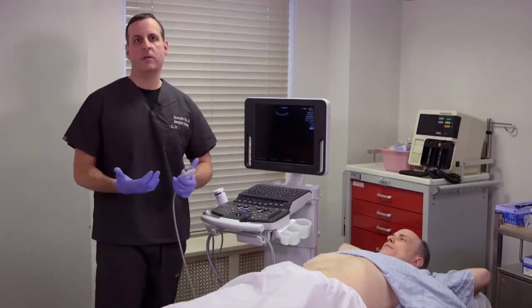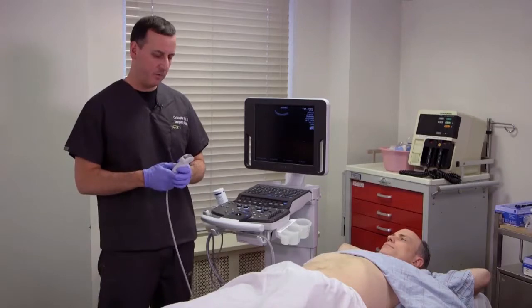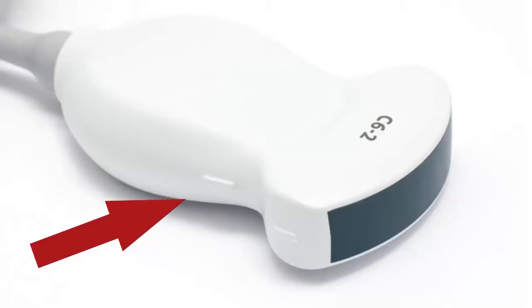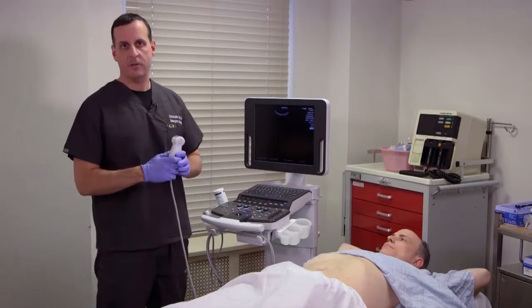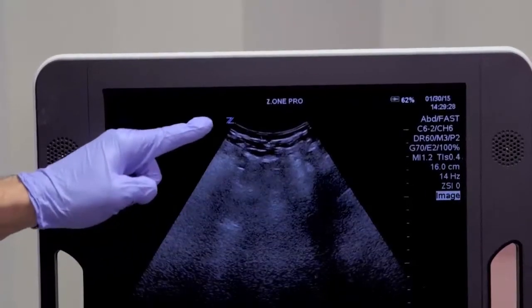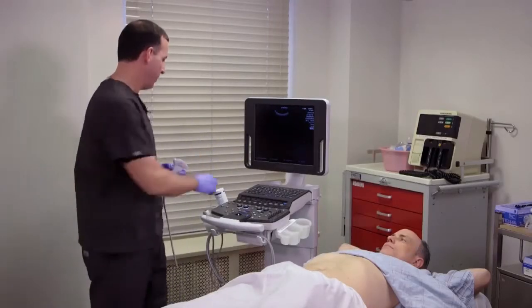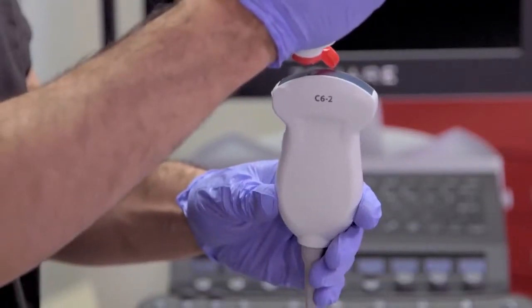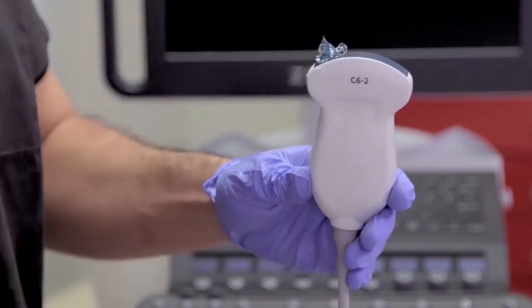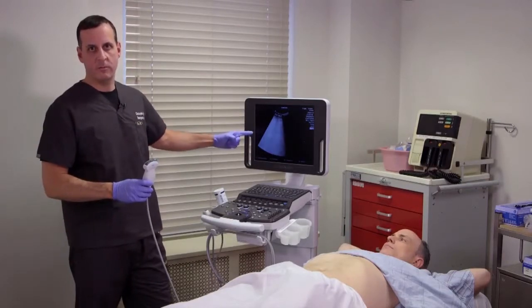Since this is one of the basic core applications, I want to review a few key important things about how to actually scan patients. Every transducer has a little notch on the probe, and that notch correlates to the Z marker on the screen. The notch gives you the location of that Z on the screen, providing your spatial orientation. If you're ever confused, you can take your gel and place it on half of the probe — as you can see on the screen, it clearly demonstrates which side of the probe you're using.